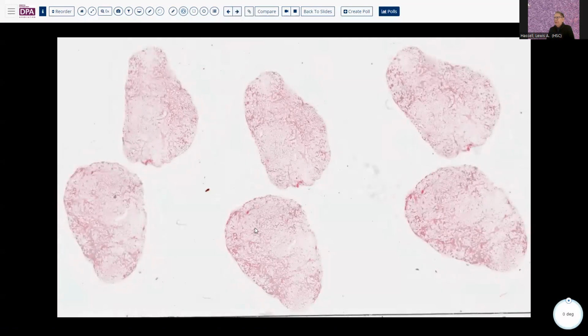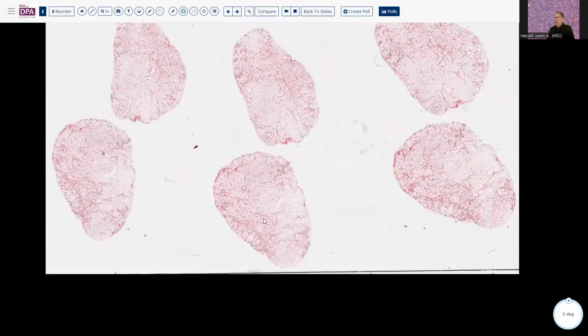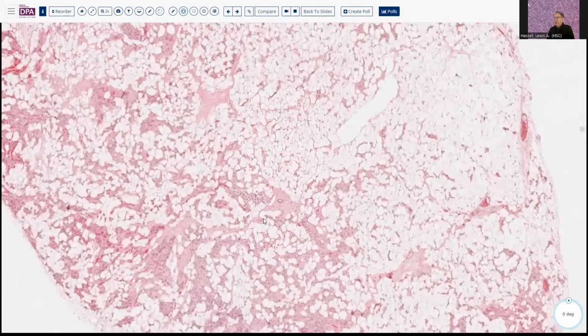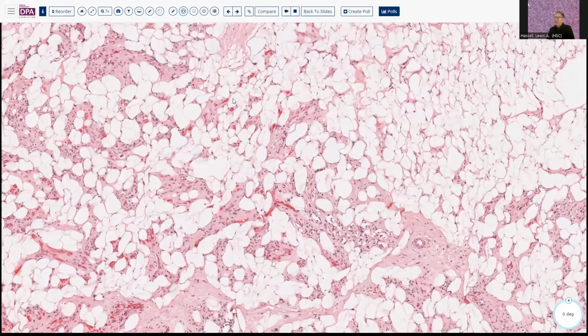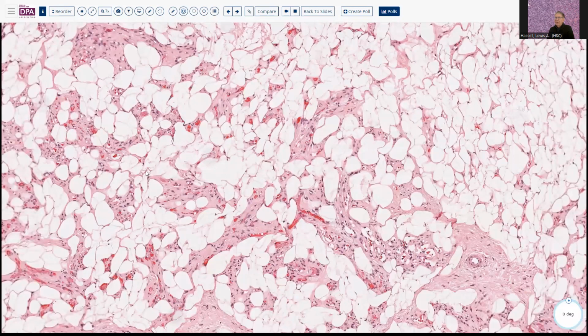And going back on the scale in terms of relative prominence of the vasculature, here's one with very little prominence to the vasculature, but present in so many of these interadipocyte spaces that I think you would have no difficulty recognizing that this tumor has a vascular component and one that should be attended to.